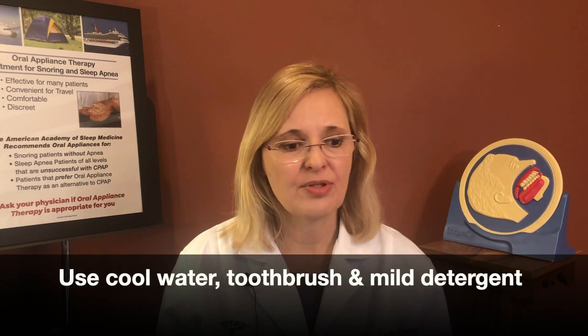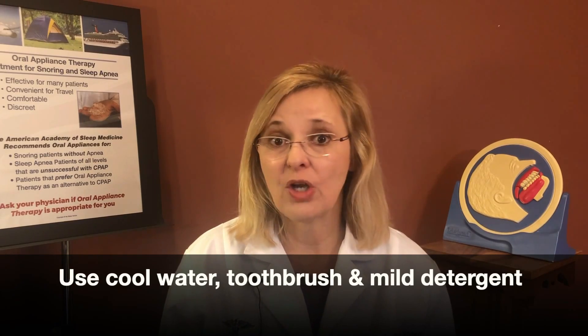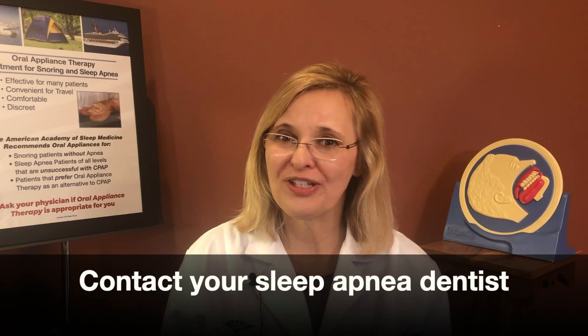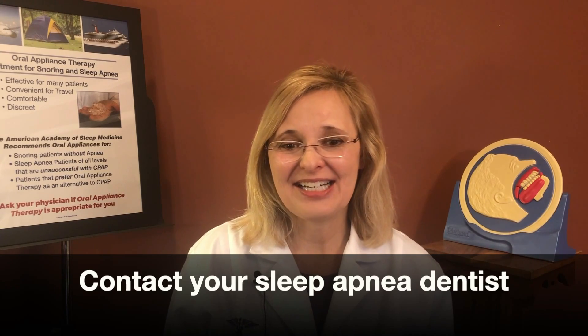To clean the device, you can use a mild detergent or toothpaste, and always use cool water. Do not place it in warm water again, as you will lose the initial tooth impressions and occlusion. Keep it away from dogs — they can chew on it! Hopefully this was a helpful video. If it was, please give me a thumbs up. Until next time, thank you so much.